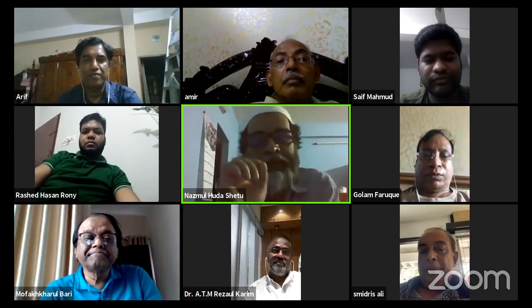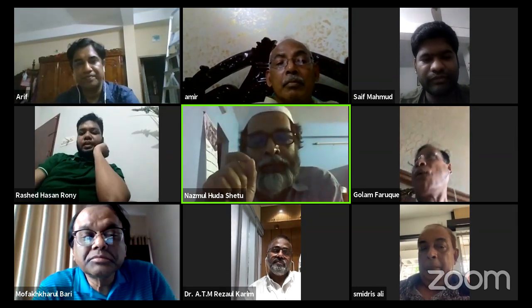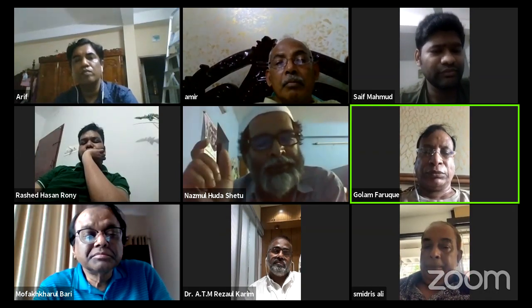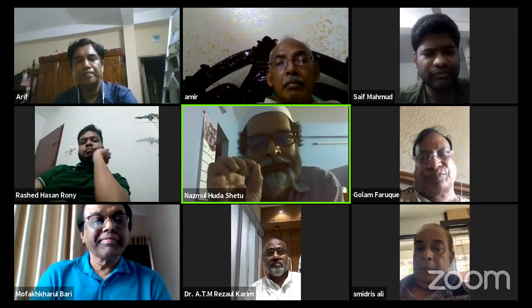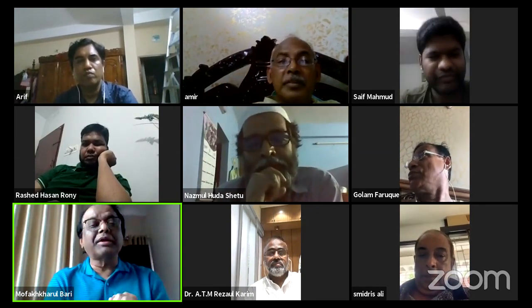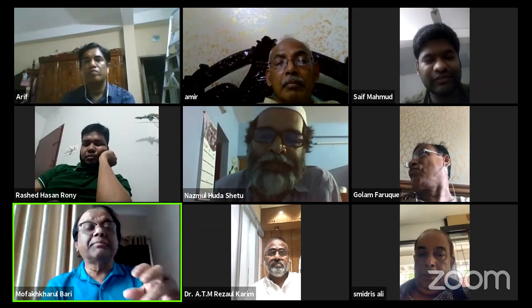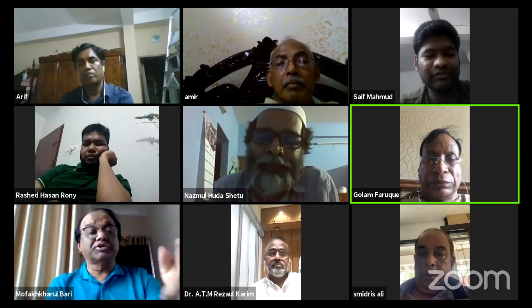Sir, I just want to ask about the presentation of Arif about the acute docking. How much acute docking is safe for humerus, for femur, for tibia? He already mentioned it there. Do you have any difference about the safe limit? Okay, I got your question. Yes, sir, he had rightly mentioned. He is right. In the tibia, in the proximal part, you can go for 2 to 3, even 4 centimeter proximal.